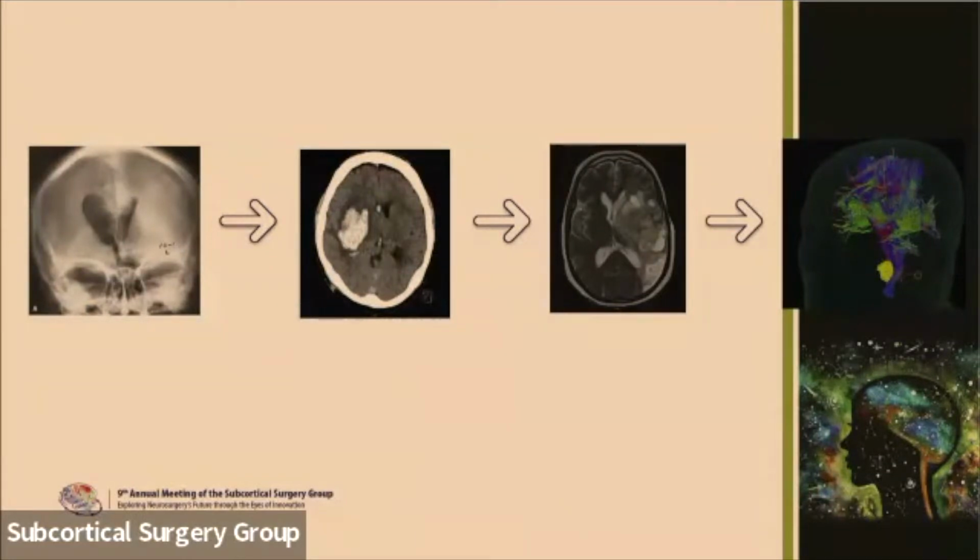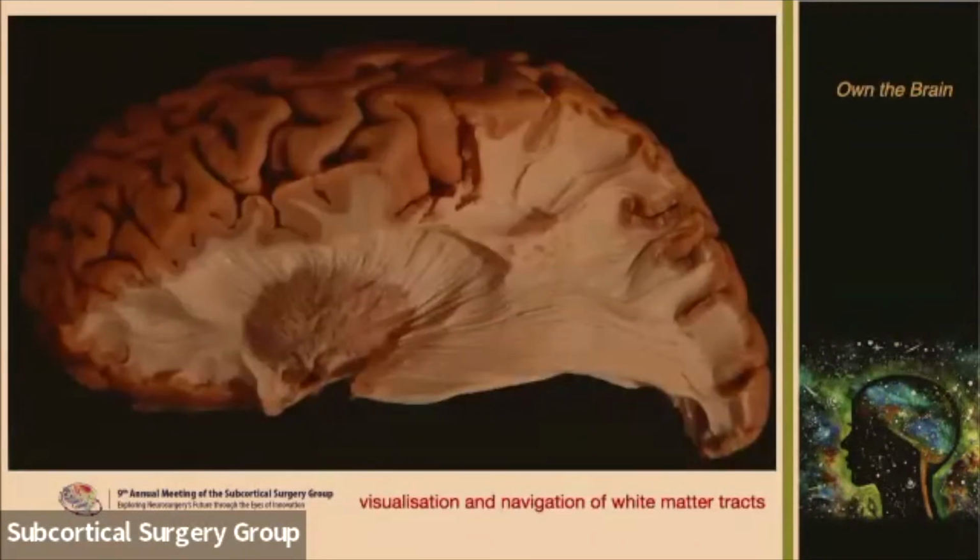So in our imaging, the common thread of all things is distortion and deviation from the normal anatomy. And I've based a lot of my quantitative work on comparing the normal hemisphere to the abnormal hemisphere. And I think we really have to visualize and understand the histological white matter and then compare that with the MRI-generated white matter, unperfected, but perfected in a way that it is applicable in the clinic.